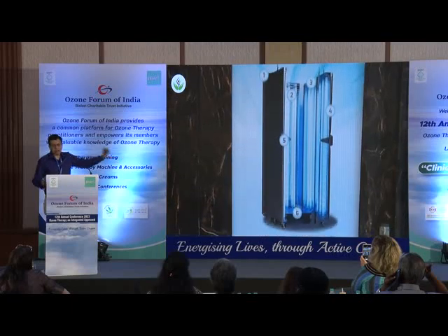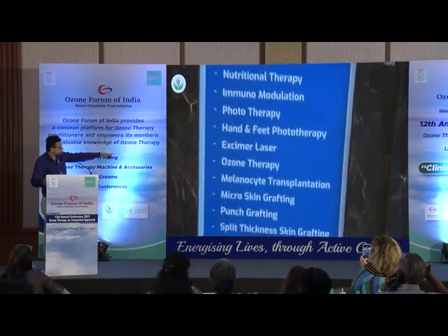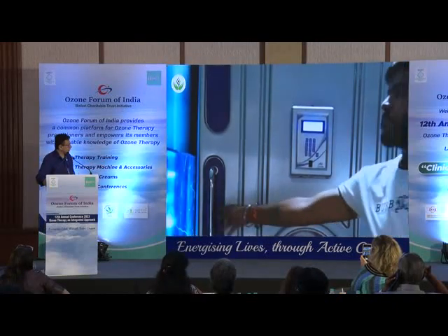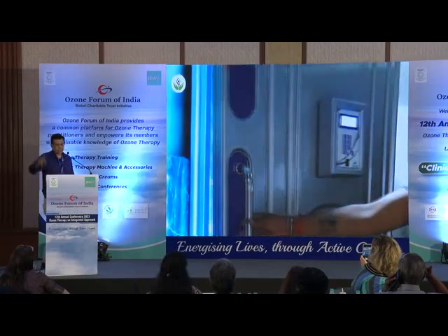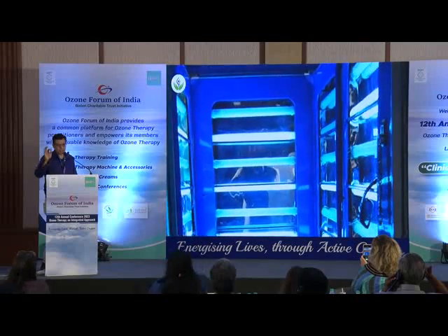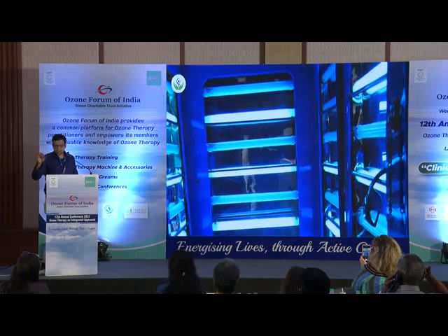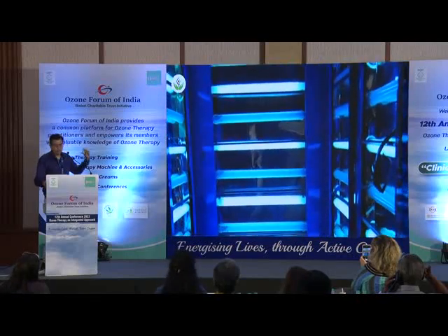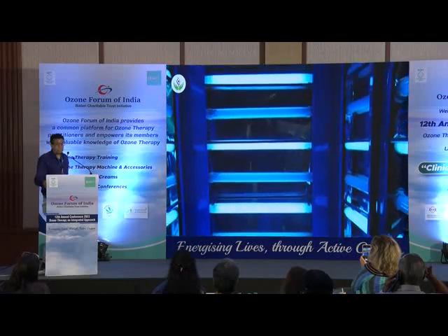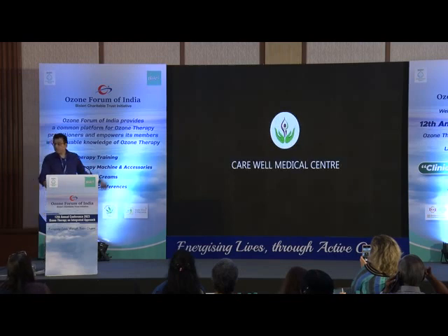This is a phototherapy chamber, a full big phototherapy chamber. And you can see I have written here, ozone therapy is another treatment which we give along with it. This is the chamber in which they go. There are two lights, UVB, UVA. Twice a week I give them UVB, once a week I give them UVA. Now most dermatologists do not use UVA. Very few dermatologists will bring UVA. I'm combining both ultraviolet B and ultraviolet A. I see very fast results coming. Okay, this is phototherapy. Short.